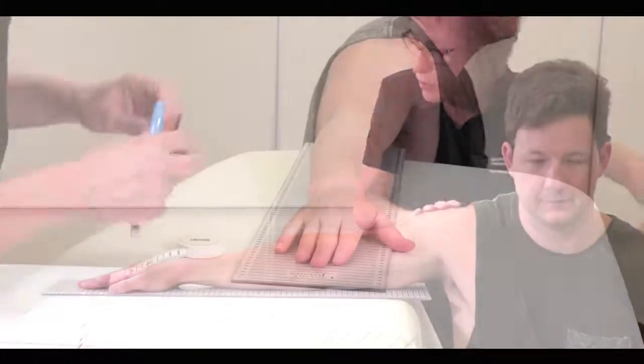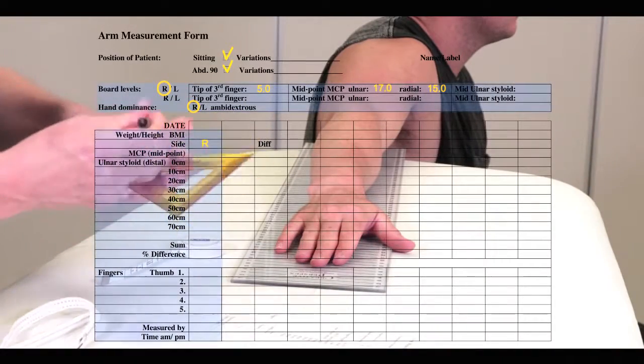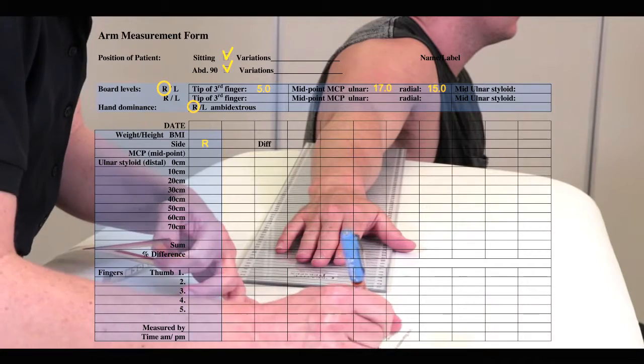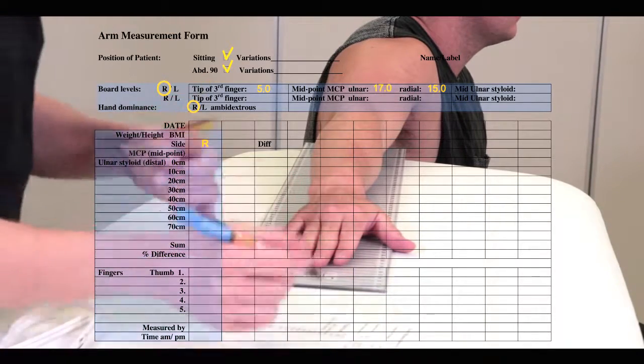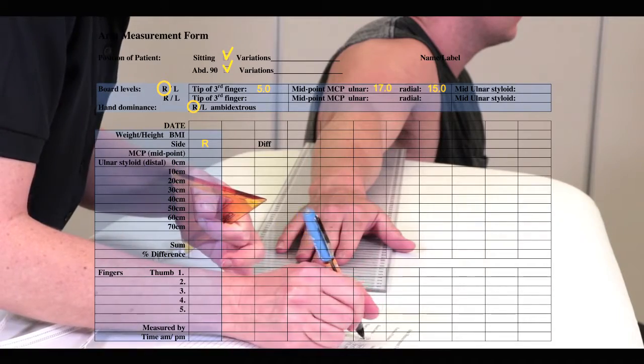Mark this or any variation on the arm measurement form. It is recommended to measure the at-risk arm first. When you measure the unaffected arm later, use the same position as for the affected arm.